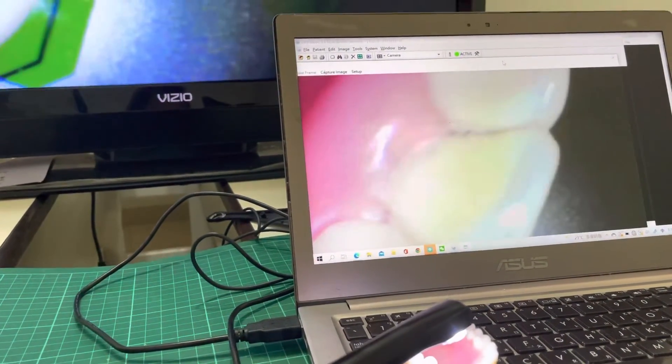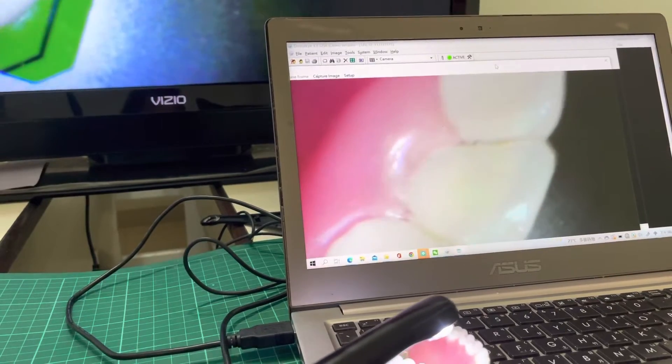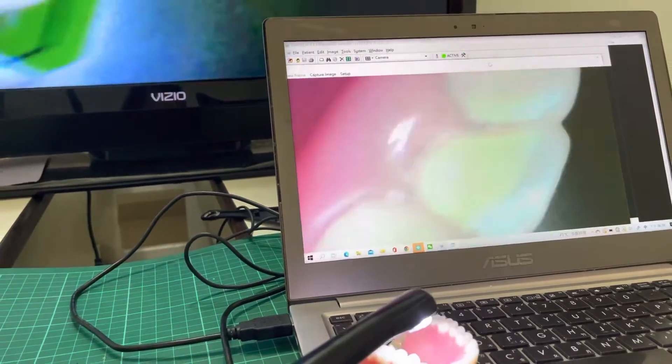In the PC, we have already installed the Dental Eye image software.